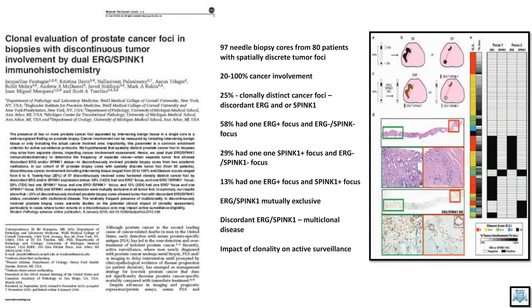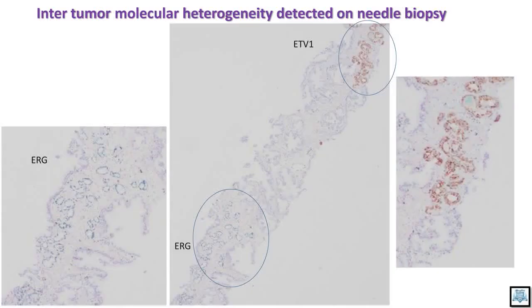So I think combining more than one marker in a multiplex approach will reveal some important information which we were not aware of before.